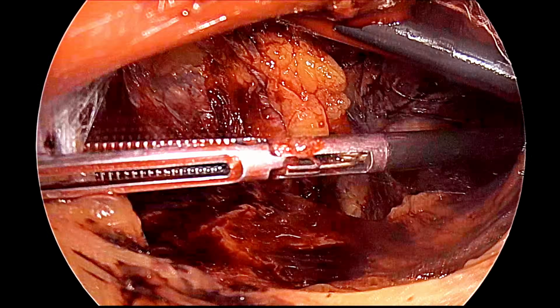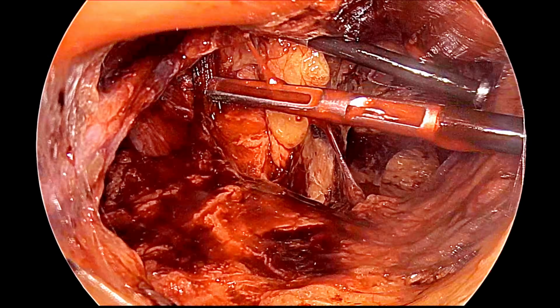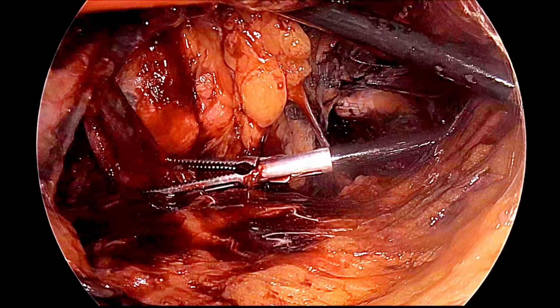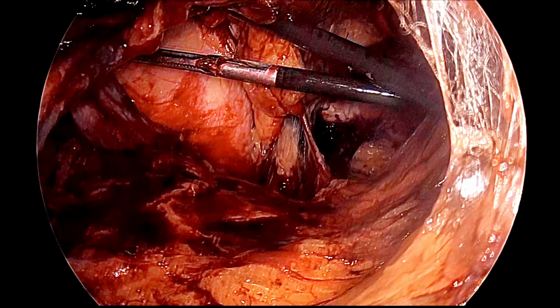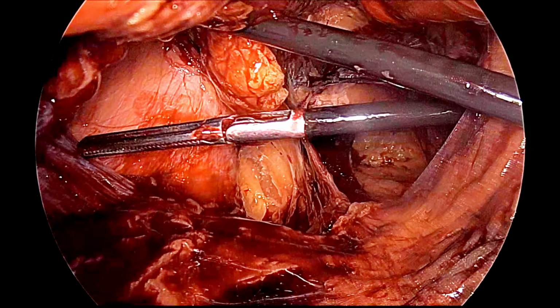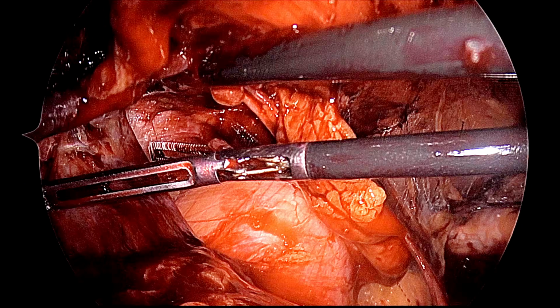So, now we can see here we are doing the lateral dissection, and in this area we can see the sac which is visible, and now first we will go medial to the sac, then lateral to the sac, and then the sac dissection. Going directly to the sac is not a good idea. So, lateral and medial dissection should be performed first.